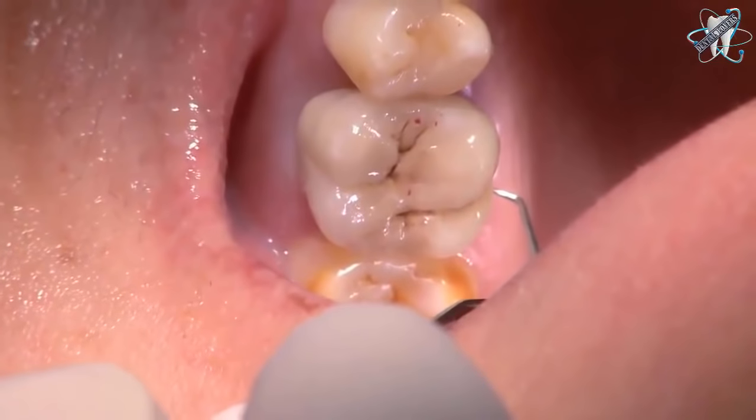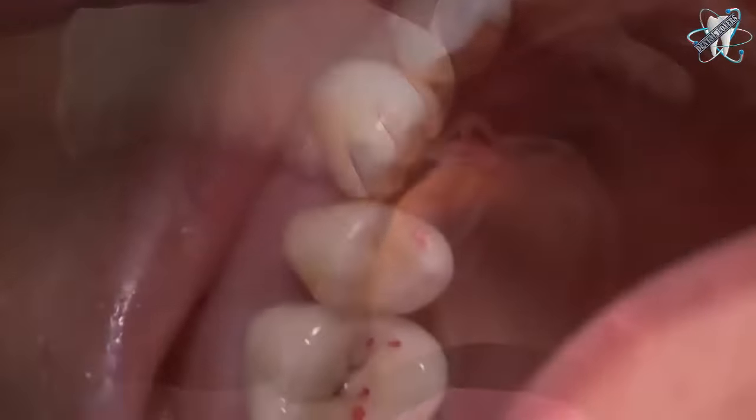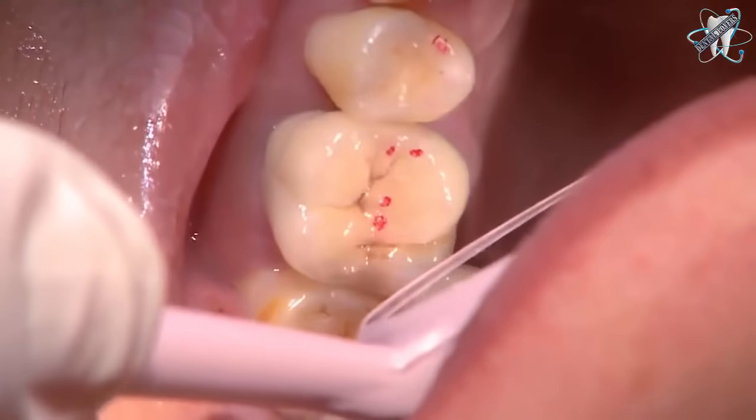The crown is seated and the marginal fit is checked. The interproximal contacts are checked and the occlusion is checked. Requiring no adjustments, the crown is ready for cementation.